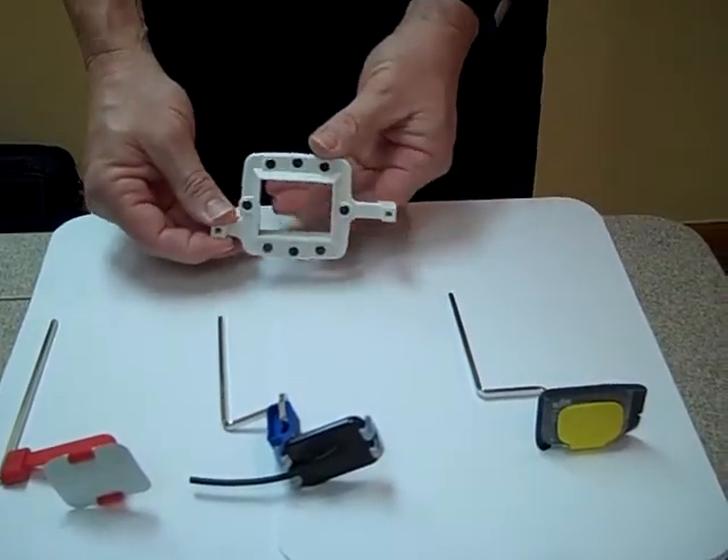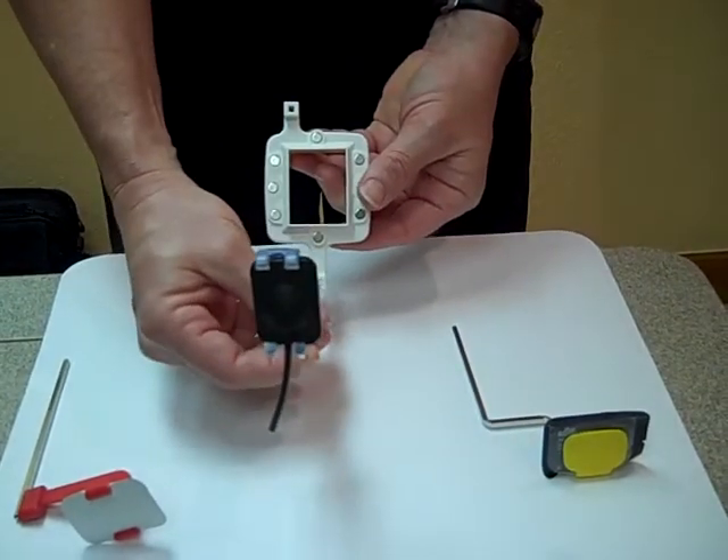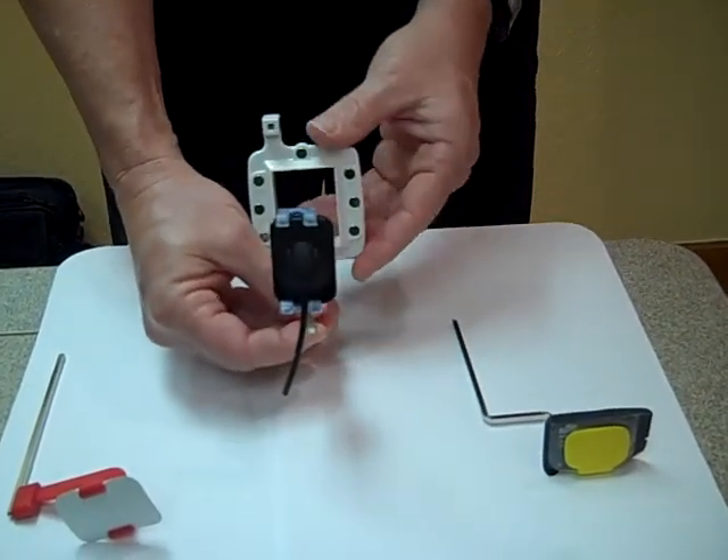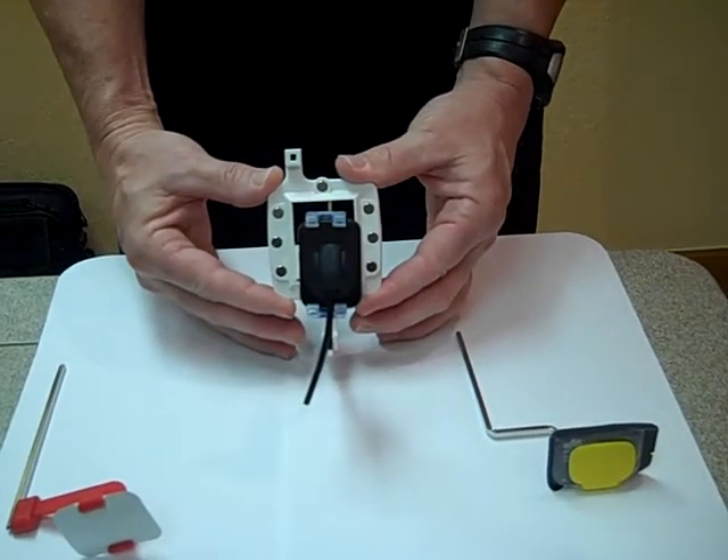If you need to take an anterior PA, you'll simply slide your bar into the longer arm and you will have perfect alignment with that receptor as well.